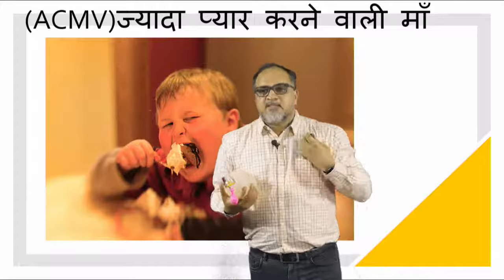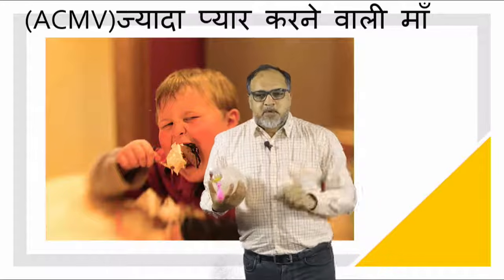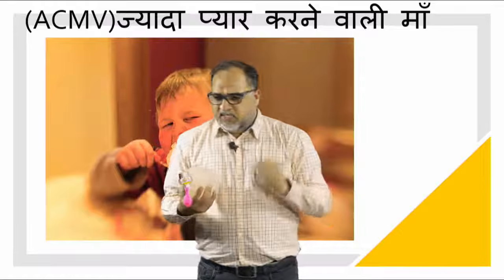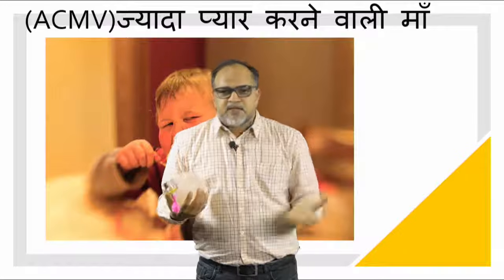Now what happens in ACMV mode? Our 10th pass boy went back. The HOD, Dr. R.D. Singh, told him, no beta, this is not working, the patient is fighting, the patient is struggling, and because of that dyssynchrony, the patient is going into hemodynamic instability. Of course, if the patient is trying to breathe in and you are giving breaths, the patient will go into hemodynamic instability, there will be tamponades being created.